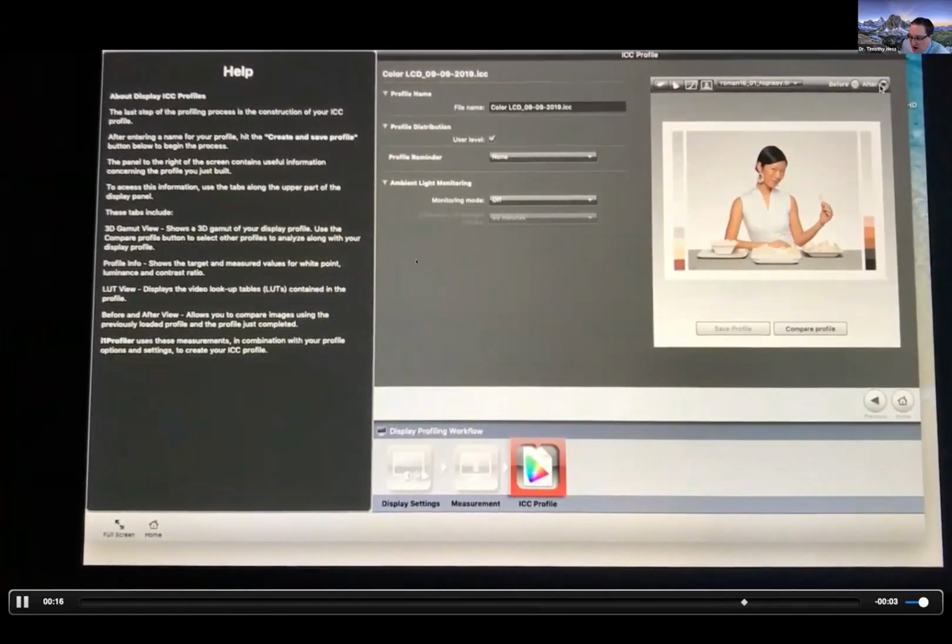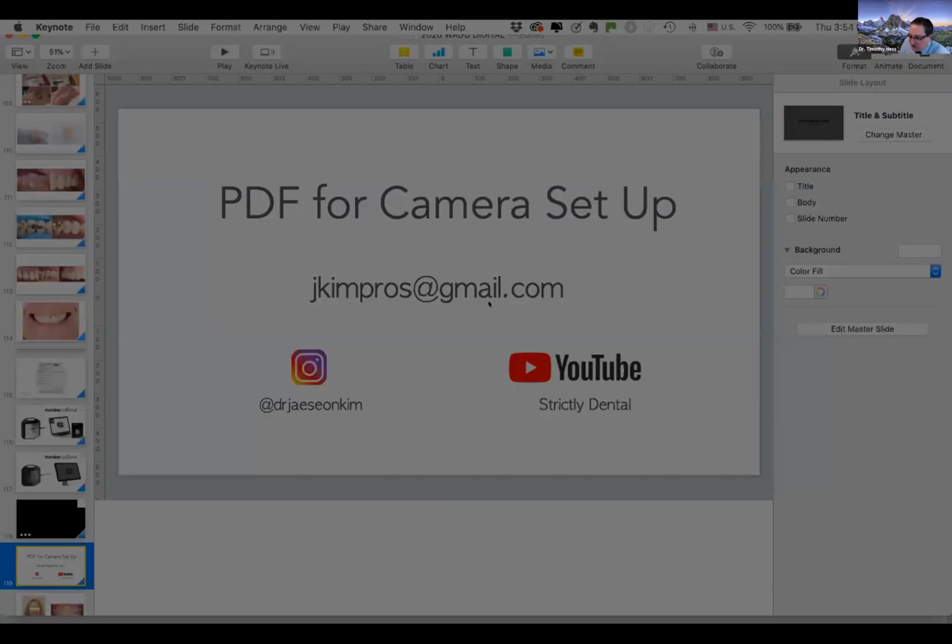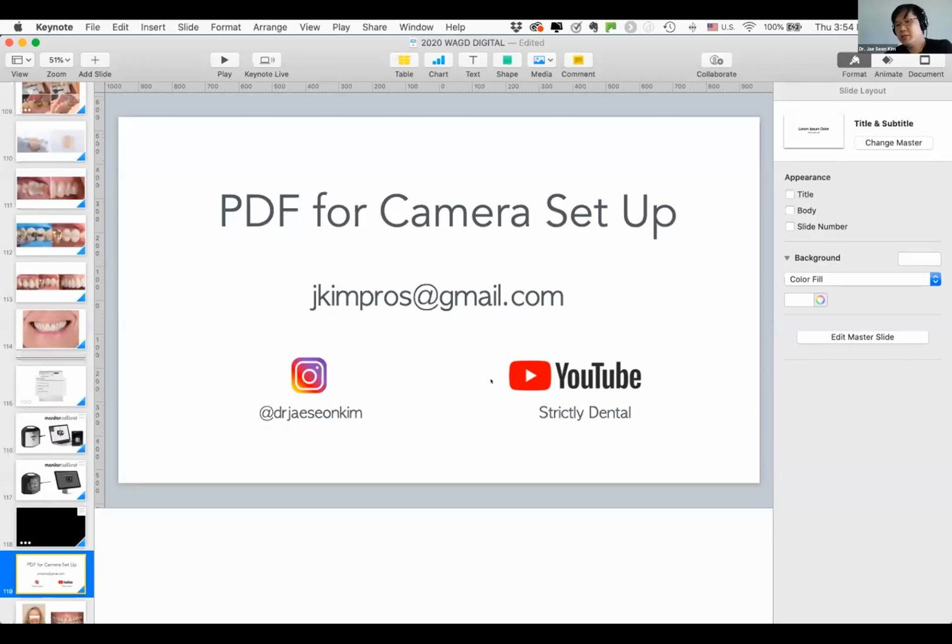Terrific. Okay, what stump guide do you use in your office? Stump guide, I know they have different stump guides for like Emax, and they have different shade guides. I just use the same Vita shade guides that I use for the stump shades. Like I said, you don't have to have the absolute same color. The shade guide is a reference. You're showing the ceramist this is what the color or the chroma is like, or the hue is like. And so I just use the same shade guide for that as well.